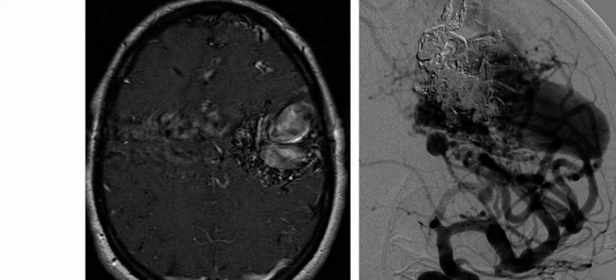And on the post-contrast sequence, you can see that there is prominent enhancement and flow-related artifact on this axial T1 post-contrast image. On the lateral oblique digital subtraction angiogram of the left internal carotid artery, you can see that there is early venous filling during the arterial phase, including the large venous aneurysm, as well as enlarged vessels feeding, draining, and within the nidus. The serpentine subtraction artifact corresponds to the partial embolization.